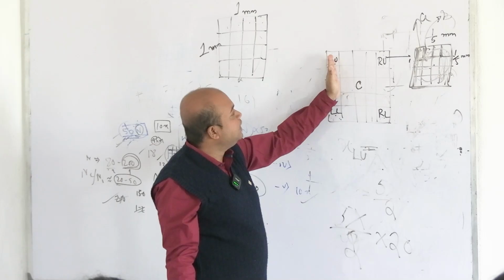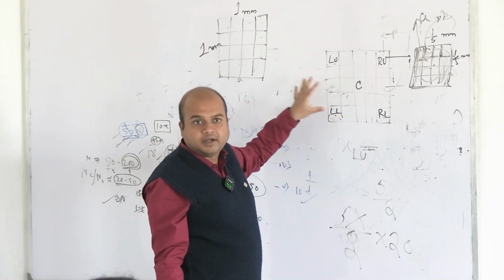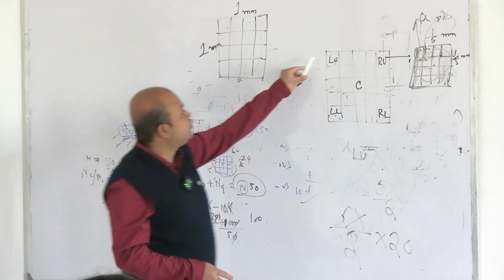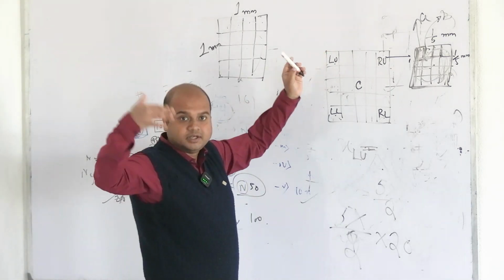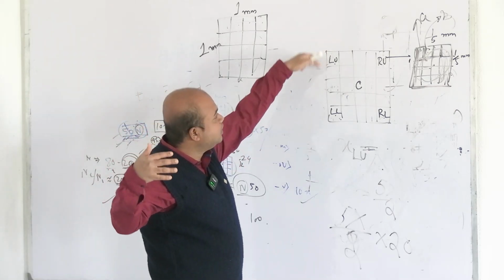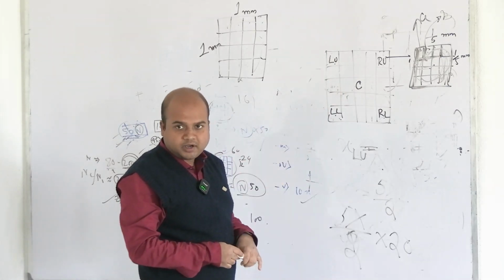On the right and lower side there will be identical RBC squares. This is how to identify any corner square. On the left and upper side are the triple lines, non-counting squares, and on the right and lower side are the identical RBC squares. This is how to identify.